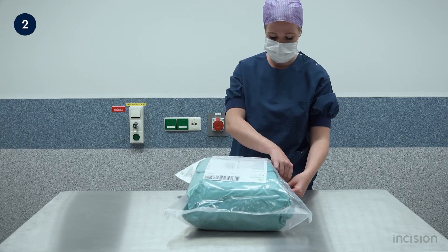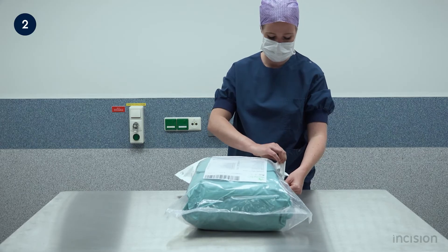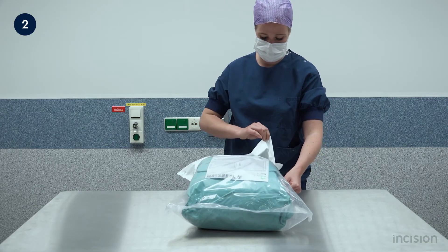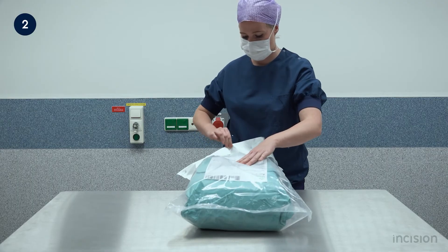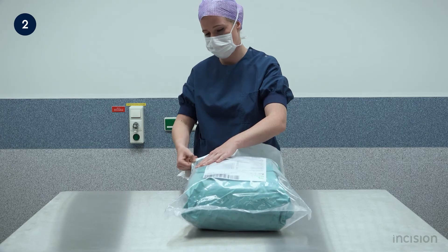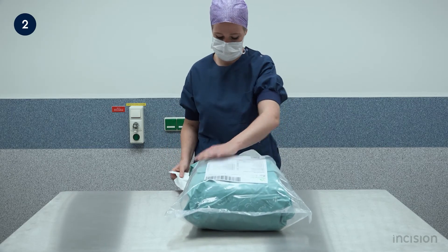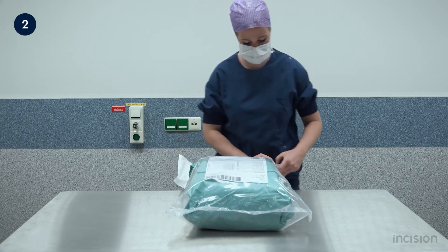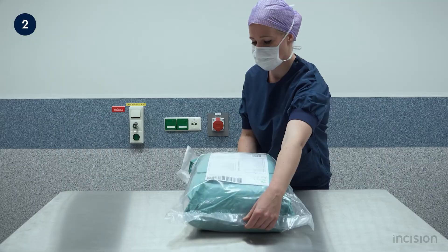The procedure pack is opened. Take note of how the scrub nurse moves confidently yet economically in doing so. This kind of movement is a recurring theme not only during table setting, but throughout the procedure to be performed.